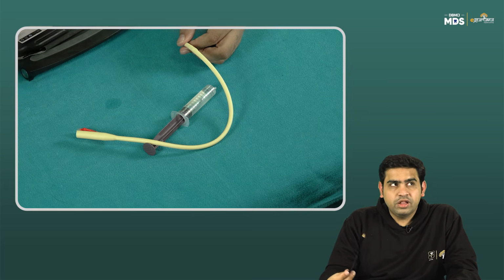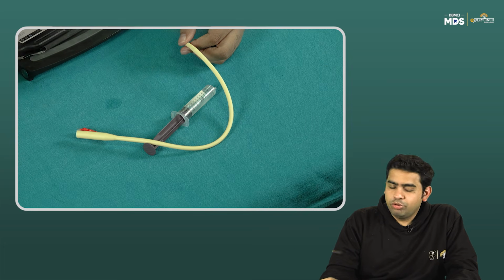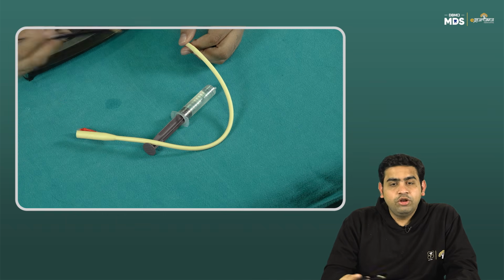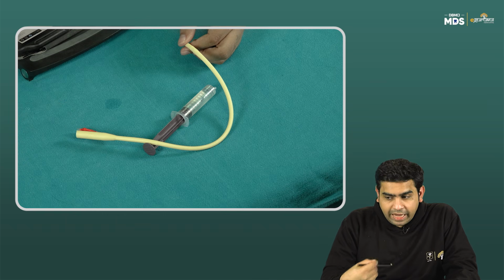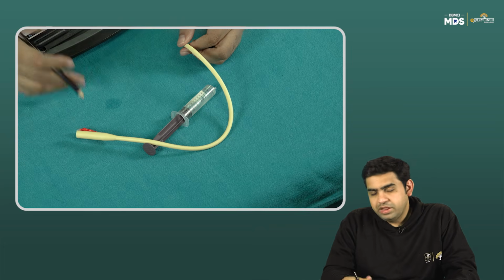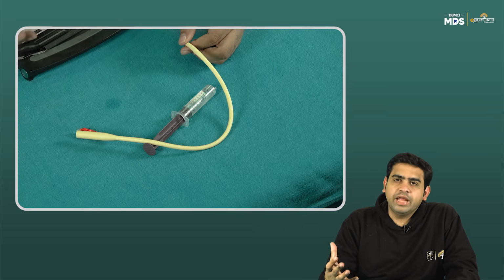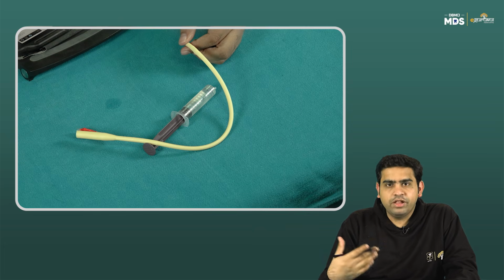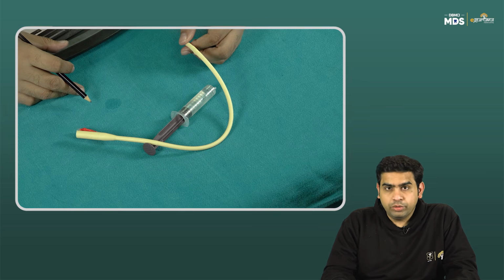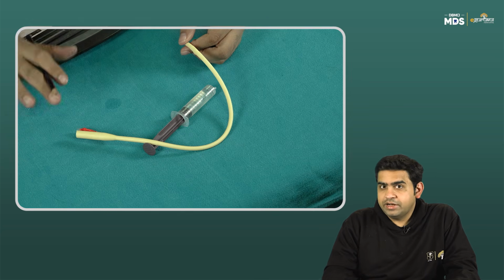When you do that, let's say post prostatectomy or something, forget about the details. All you need to understand is, if in your life you are catheterizing a small child, 8 years old, you might use even smaller catheters. We have catheters of 8 French, 6 French also, but they do not inflate 10 ml. It's not a dictum that every catheter has to be inflated.